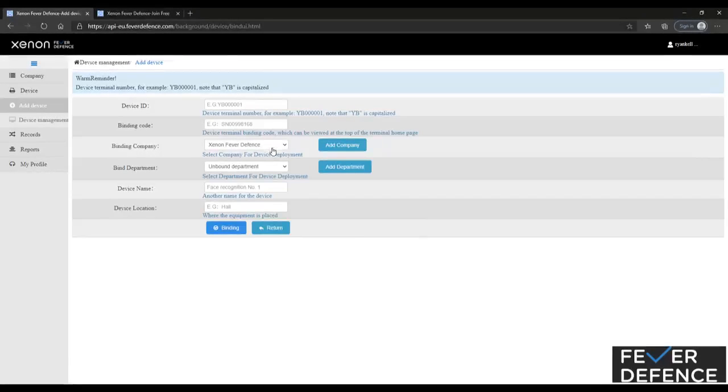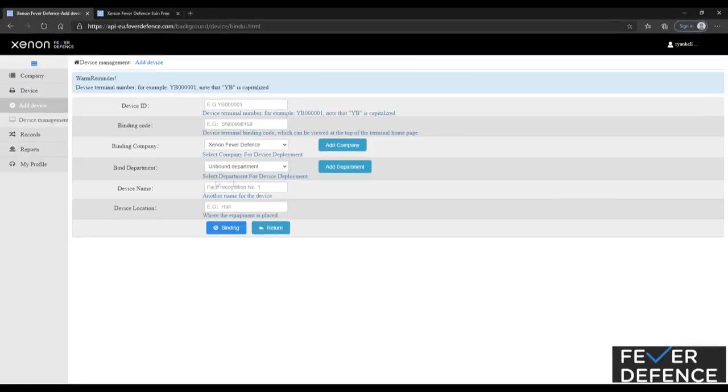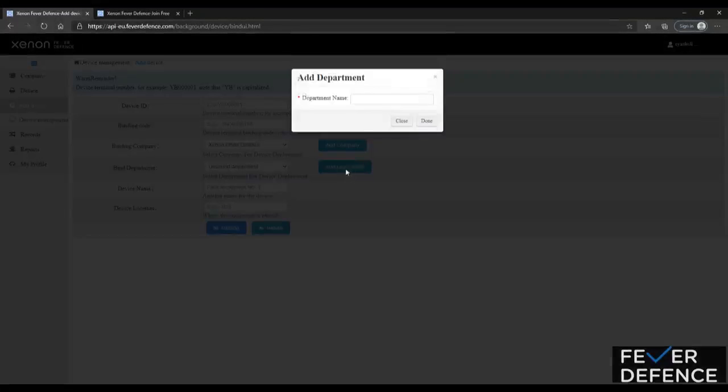company name, which you will have set up as you've started here. So you're going to add a company and you're going to add a department.